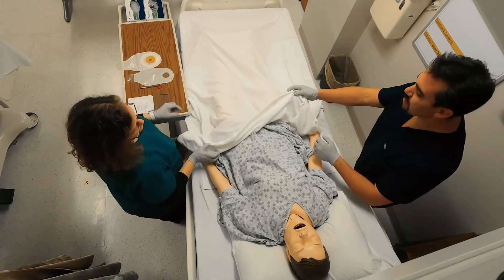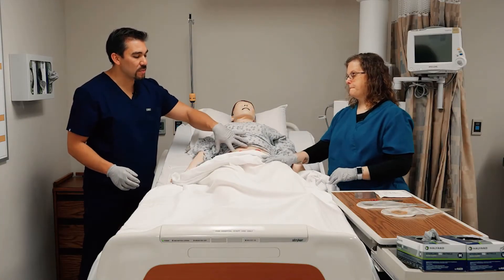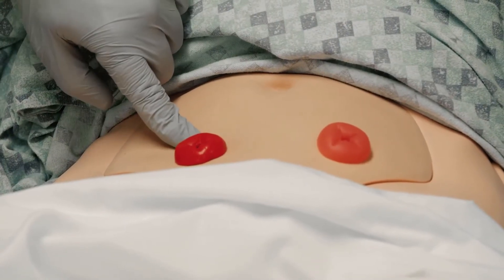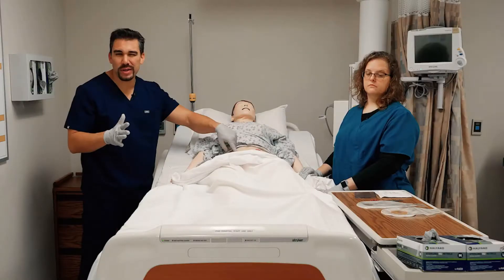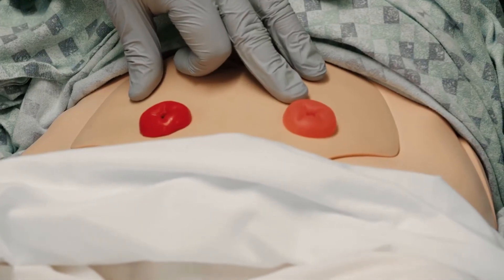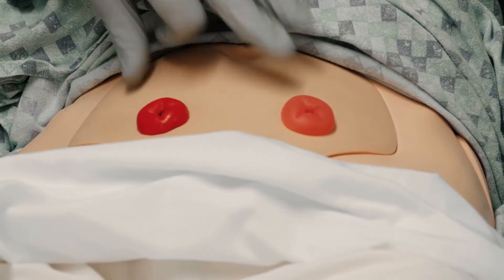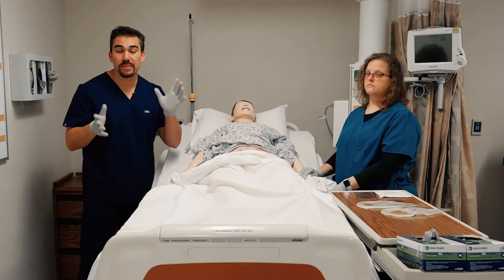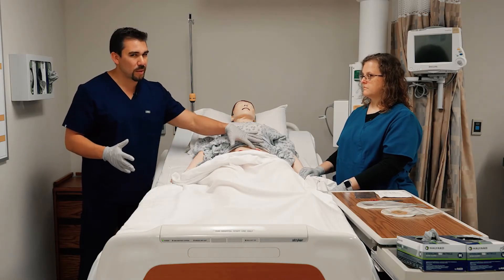When looking at the stoma itself, we have a red beefy one and a pink one. The red beefy is for fresh new ostomies, usually around seven days old. The pink should be pink and moist for the duration of long-term use — kind of like your lips. You never want them gray, blue, dusky, or pale. That means decreased perfusion, or basically decreased blood flow, and we have a big problem there.